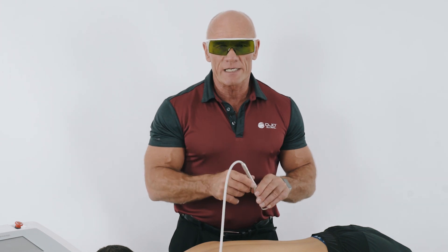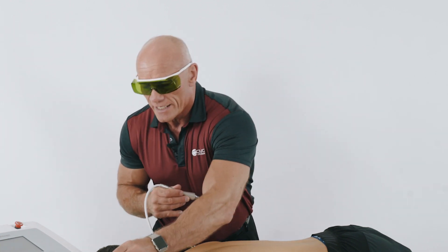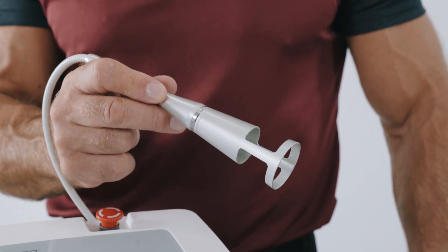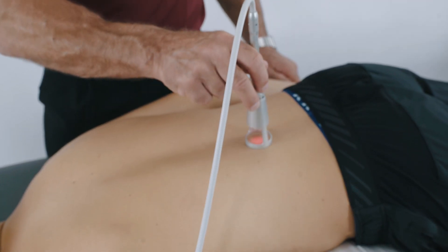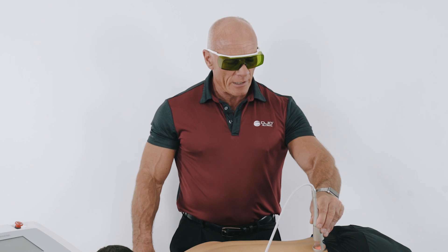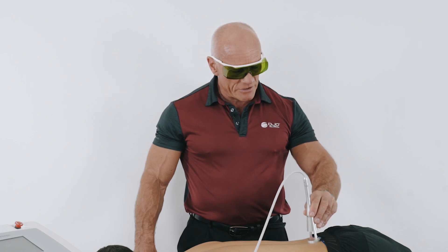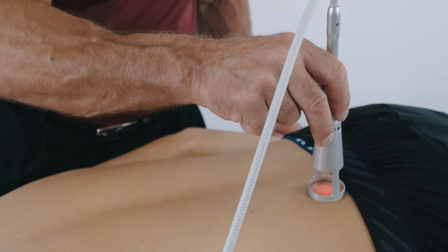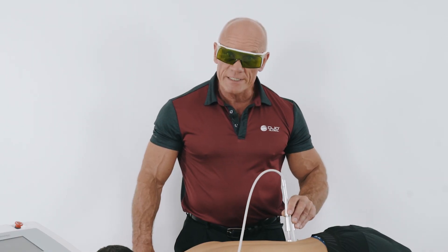During phase three, because this area is quite acute, I'm going to change to a standoff with a lower energy density. During phase three I'm using a scanning technique. The purpose of phase three is to create biostimulation of the cellular activity. So in order that I don't miss any of those cells in that area, I go transversely and then longitudinally over the tissue. And I repeat that process until phase three has finished.